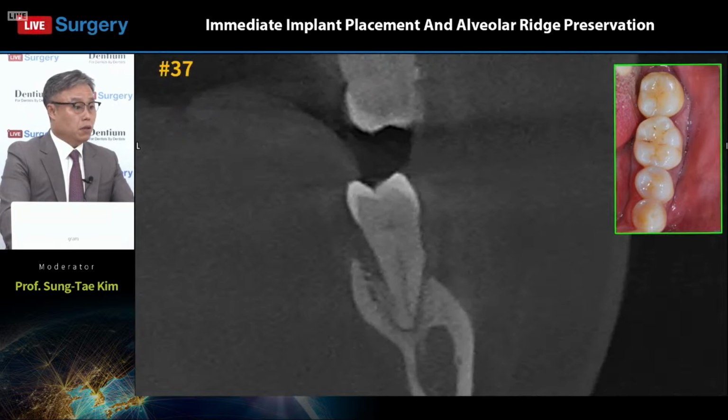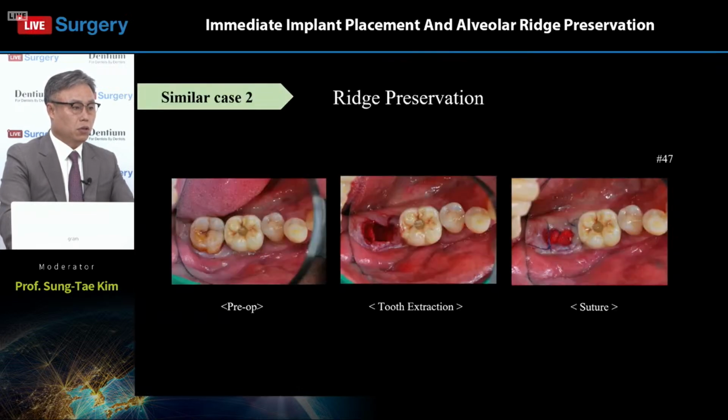Yeah, if you see in the cone-beam CT, there's widening and loss of the periodontal ligament, and some lesion on the buccal and the lingual side also. So that's why the surgeon decided to extract the tooth.